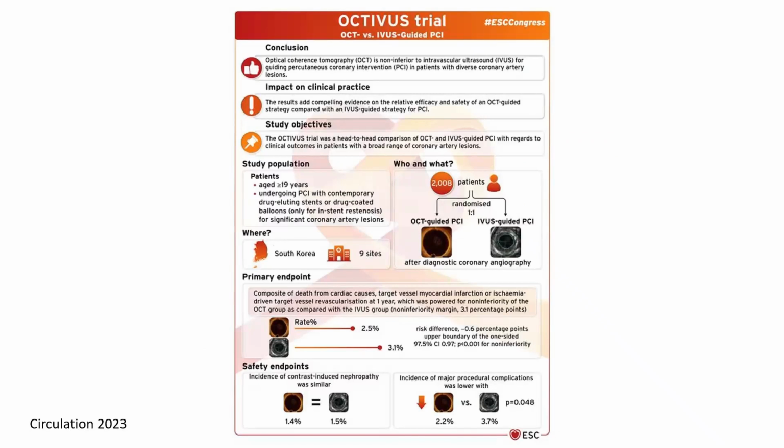I will finish with this trial also presented at ESC 2023 and published in Circulation, the Octivus trial. This is a large trial comparing OCT guidance versus IVUS guidance, and it showed the same long-term low risk of target vessel failure, again showing that it is fine to use either modality as long as you know how to react to the data properly.